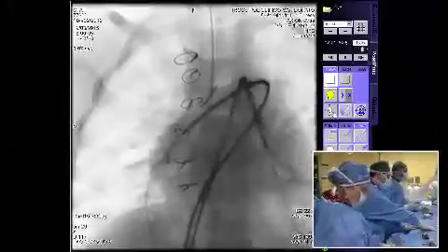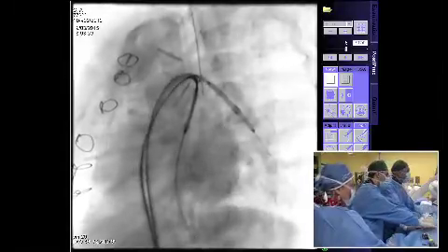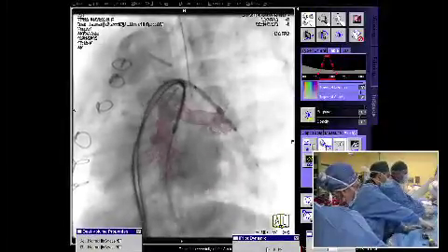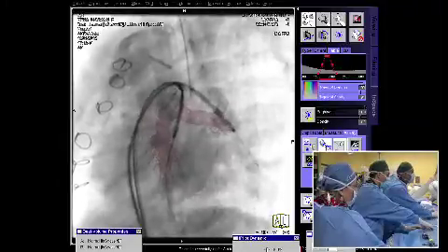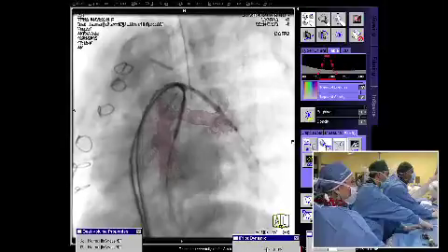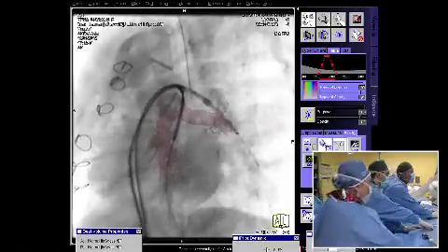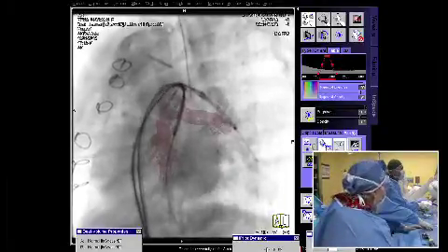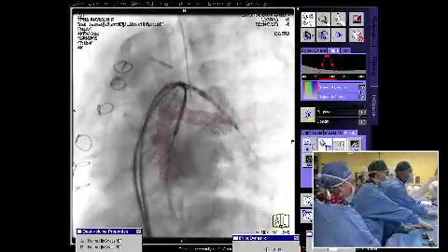What do you think? Gianfranco, this is Oliver Stumper from Birmingham. I think your left stent is far too long. You're straddling way into the lower lobe. Also, could you tell us the distal LPA pressures? Because I share the comment that it actually doesn't look too bad to give him systemic RV pressure. I've not heard very well, sorry. May you repeat your comment? I think on the caudal angulation angiogram, your left pulmonary artery stent is far too long. It reaches way down into the lower lobe.